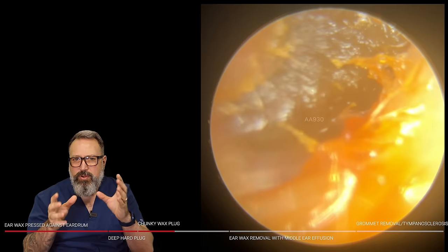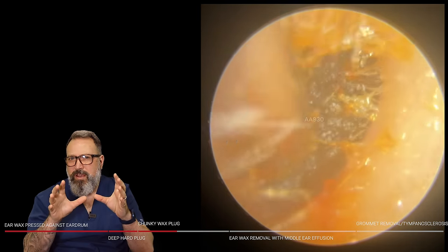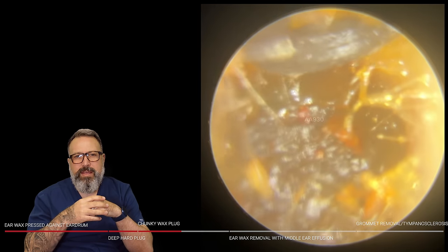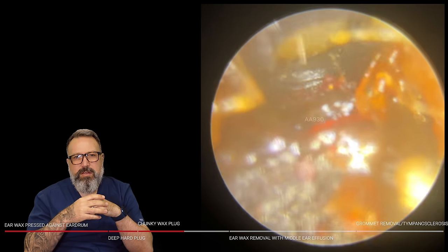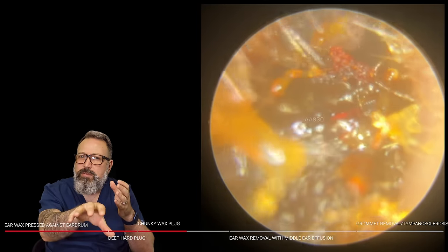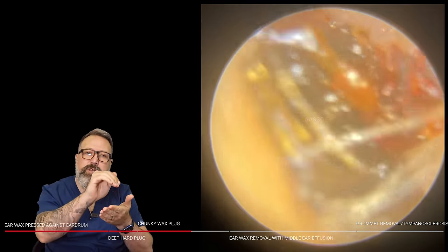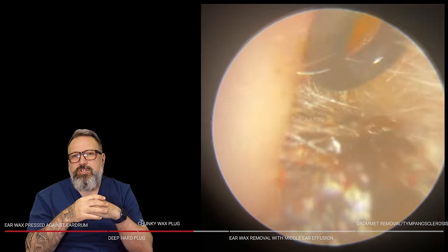I've got it moving — the bottom is dislodged but the top right section is just holding everything in. I'm trying to wiggle and circle it around to loosen this up. We're going to bring in the Jobson Horne now. As I put a little bit of pressure on, the plug dropped further back into the canal, so we have to be careful not to inadvertently push it further. I've made a little ledge in the top of the wax so we can get a grip and pull this forward.